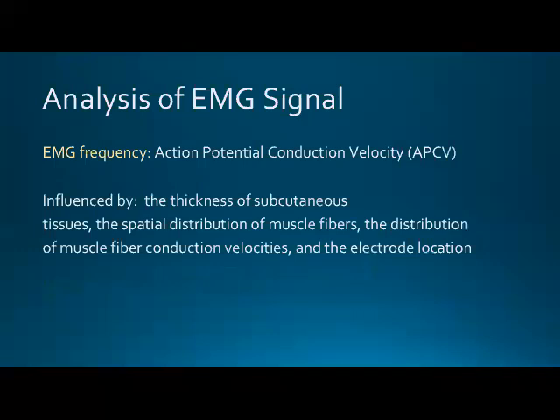The action potential can be influenced by a multitude of factors, just like EMG amplitude could. Remember, this is specifically talking about surface EMG. If you have the sensors on the surface of the skin, it can be affected by subcutaneous tissue. So often you will try the best you can to control for body fat if possible. If you're doing a study where the primary outcome measure is neuromuscular function using these non-invasive tools, a lot of studies will just use BMI to make sure you're not getting any gross obesity in the study.